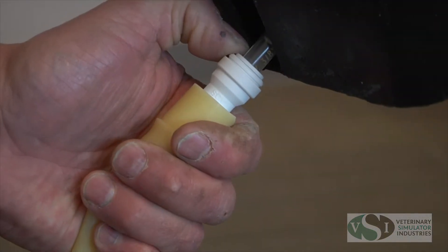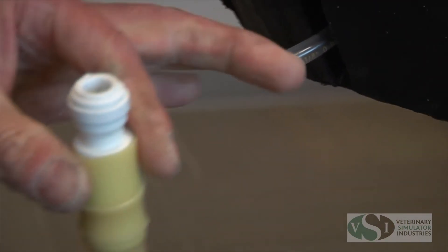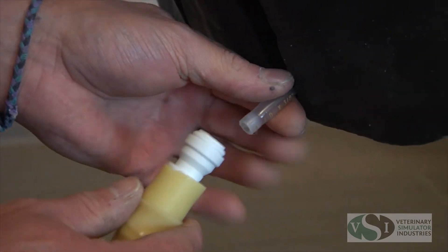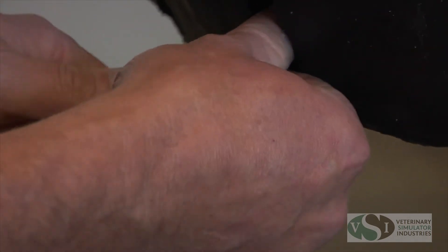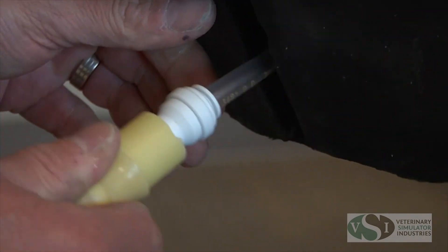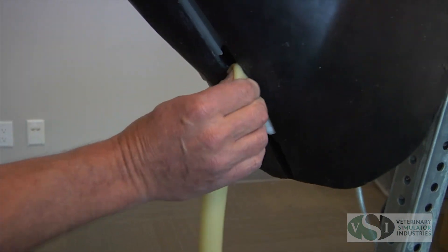Gently push down on the valve to release it from the clear tubing. When replacing the valve, ensure that the connection between the valve and the clear tubing is a tight fit. The vein tubing can then be placed back in the jugular groove.